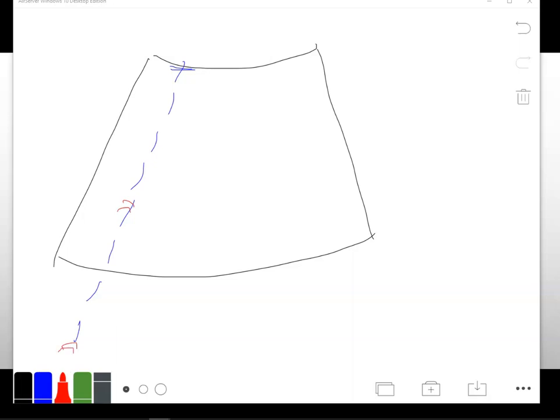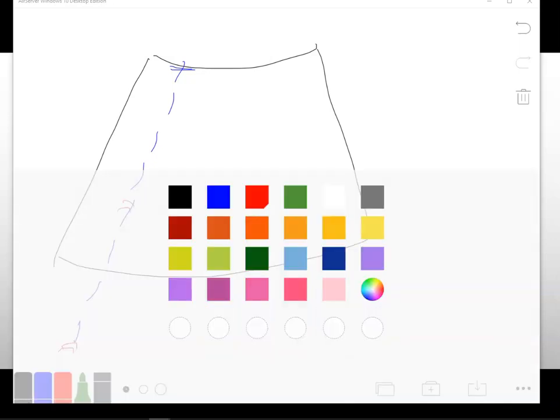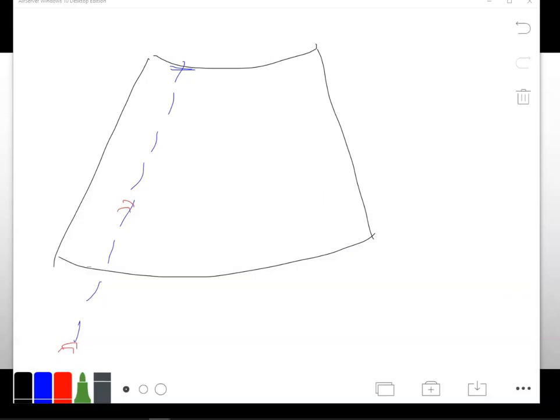Okay, so we listen, our PRP is set to listen until we get to this level here, right there. But this echo that is down here is going to return later, and so it's actually going to get to our transducer as if it was coming from a structure up here.